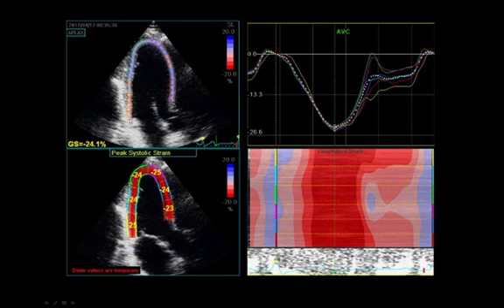Obviously, we know the system is tracking speckles behind this map of dots that separate the base, mid, and apex, and tracks the shortening and makes an average of, let's say, for example, here the anteroseptal base from one dot to this dot, from this dot to this dot, from this dot to this dot. The system tracks from frame to frame the shortening that is occurring, and if there is a concordance, I believe their secret algorithm is that there's a concordance of 70% or more between them, then you get a reported accepted measure in terms of their own internal quality of 23% average reduction.